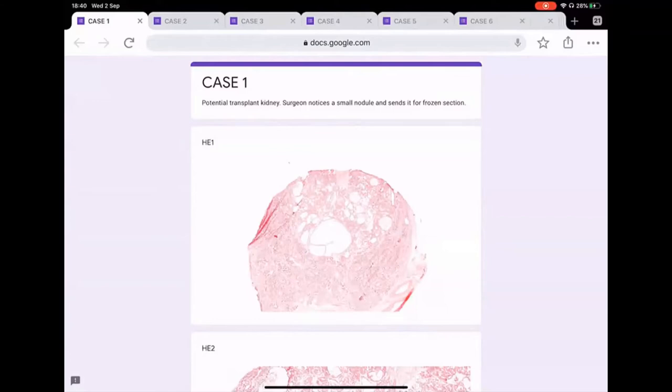I remember in my exam, in my frozen section, I did have a lung section with lymphoid infiltrate. I said there is no epithelial malignancy. However, this is a lymphoid-rich section. I will have to defer it to the immunohistochemistry because I need to get more information out of this. You might provoke the examiner by saying something like that, and they said, so do you think it is benign or malignant? So you say, all I can say now is this is a lymphoid-rich section, a lymphoproliferative disorder cannot be excluded. I am going to defer the case for the paraffin section and do immunohistochemistry on this. This is a scenario of deferral, for example.